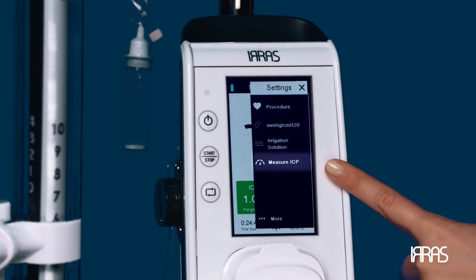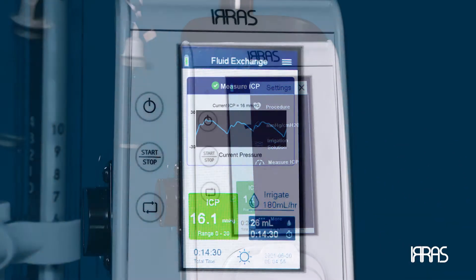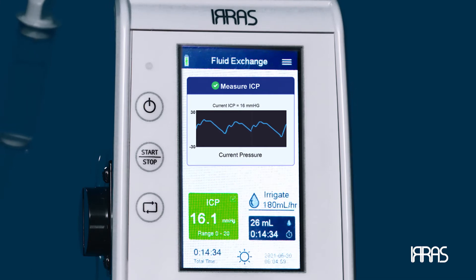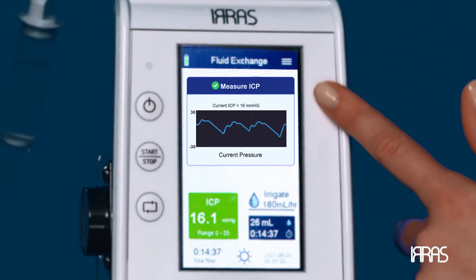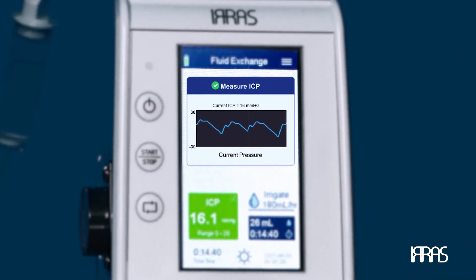Single ICP measurement — to perform a single ICP measurement, go to the settings menu and press the ICP measurement option. This will pause treatment for one minute to accurately measure ICP. Confirm you want to pause treatment; during this time the measuring ICP scale will appear, allowing the user to assess the current ICP waveform.